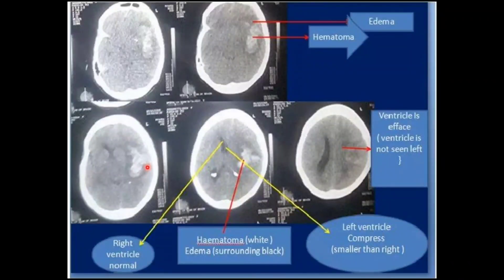These examples show intracerebral hemorrhage without ventricular extension. The hemorrhages are completely surrounded by brain parenchyma, the overlying subarachnoid spaces are normal, the ventricular system is clear with no blood in it, and the cerebral sulci contain no blood — purely intracerebral hematoma without ventricular extension.